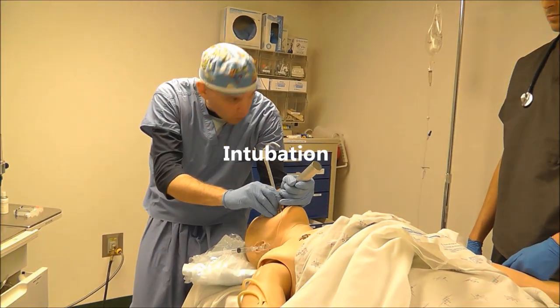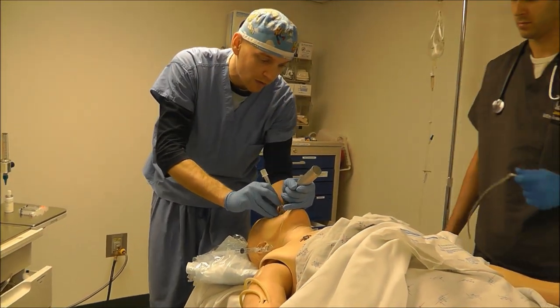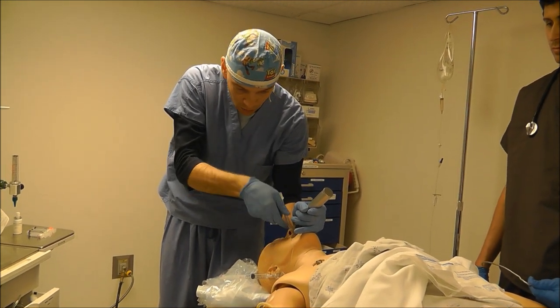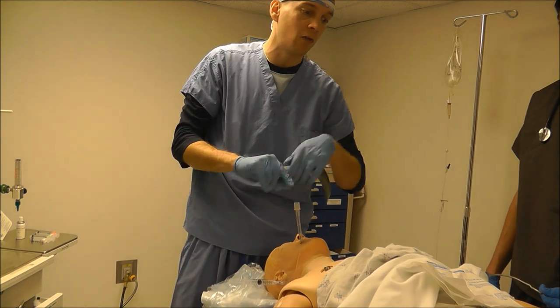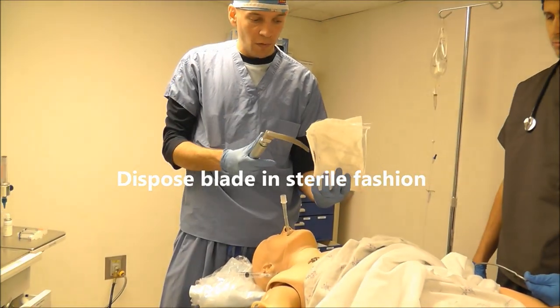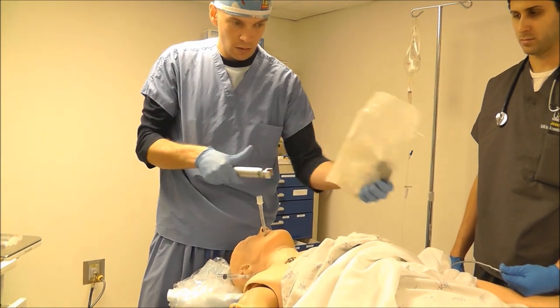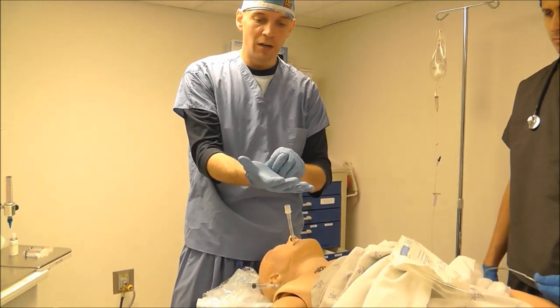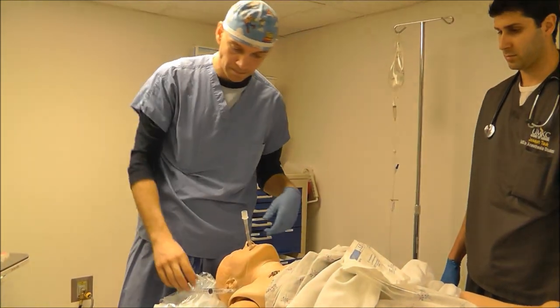Once you get to the vocal cords, go ahead and pull the stylet out. Have them pull the stylet out as you advance — do not let them pull the endotracheal tube out. Then we're going to dispose of the blade in sterile fashion, and if we use the scissor technique when intubating, we'll go ahead and get rid of that right glove.